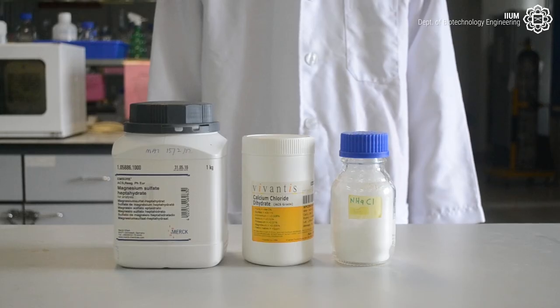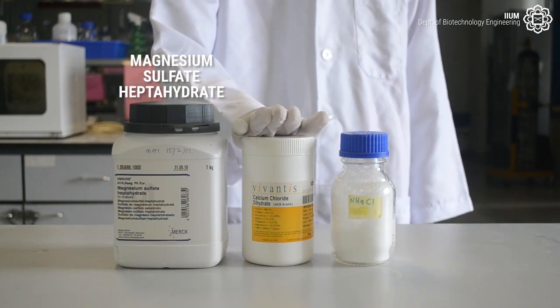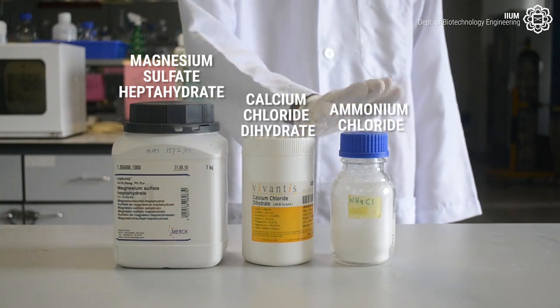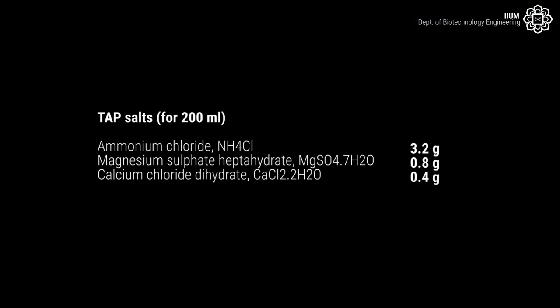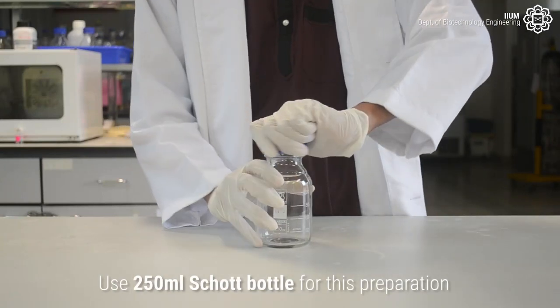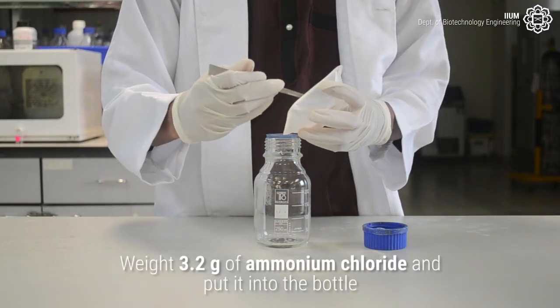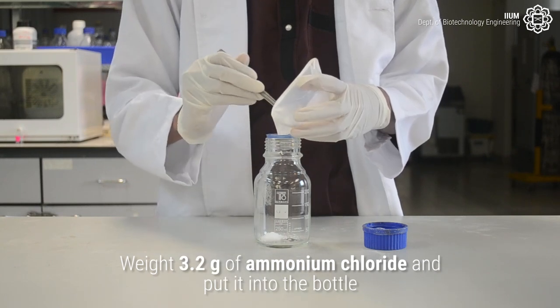To make TAP salt, we need magnesium sulfate heptahydrate, calcium chloride dihydrate, and ammonium chloride. Use the 250ml Schott bottle for this preparation. First, weigh 3.2 grams of ammonium chloride and put it in the bottle.